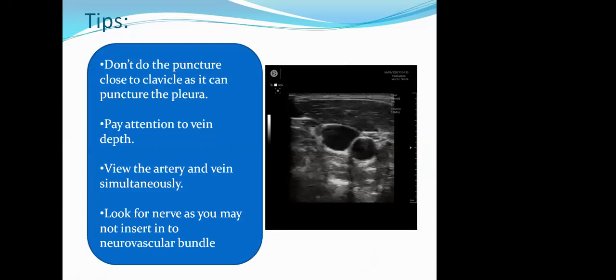Just a few tips: don't puncture the vein very close to the clavicle, because in that case you might puncture the pleura. And always pay attention to the depth of the vein. If you look over here, the skin is here, and I can very easily have an idea what kind of needle length I should pick for puncture into the internal jugular vein. Look here, my measurement is written, all the scale is over here, and this is my vein. So I can easily select a proper length of the needle.